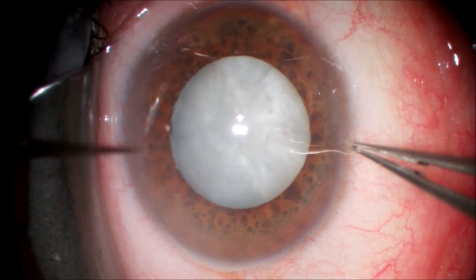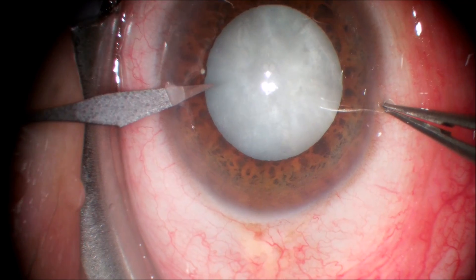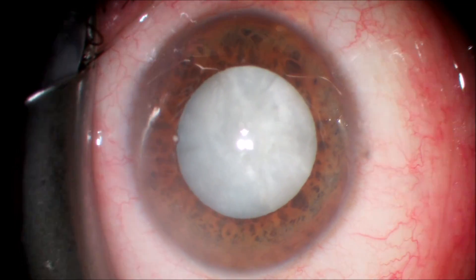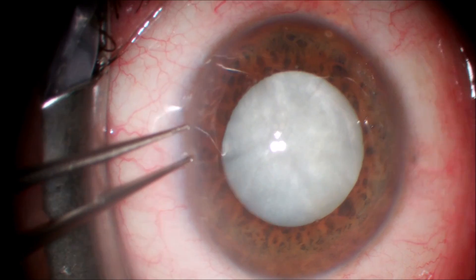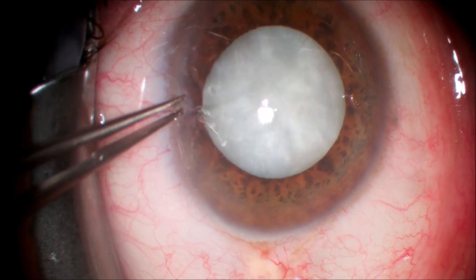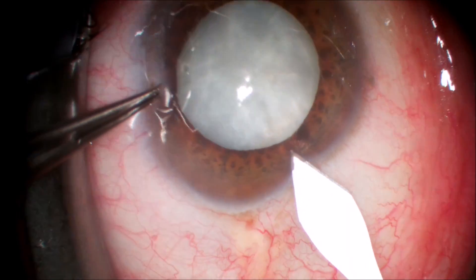We start our cataract surgery with our typical superior side port incision using a 15-degree blade. We're going to make a main incision using a 2.8 millimeter keratome. I do this before I put a capsular dye in. In this case we're using trypan blue, and that's because it gives an easy evacuation of the dye using BSS on a 27-gauge cannula.